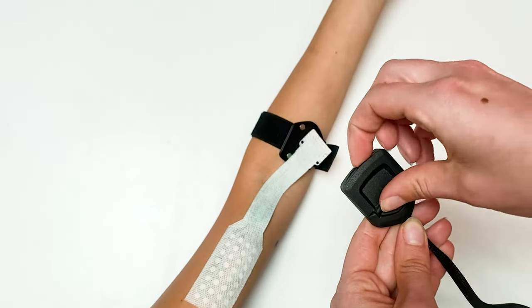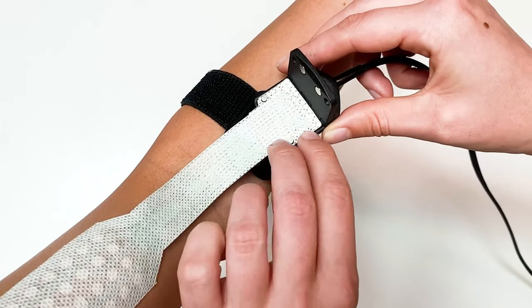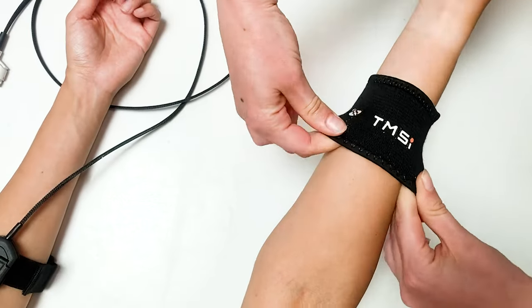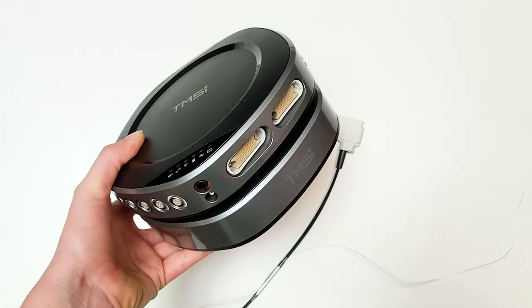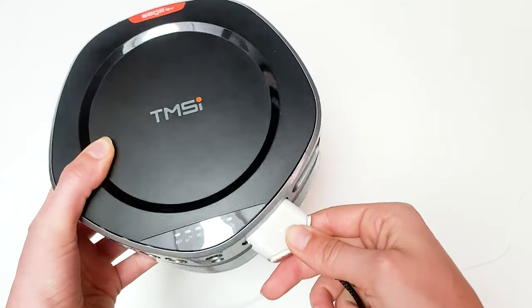Open the lid of the adapter cable and connect the grid by aligning the holes of the grid with the holes of the adapter cable, with the electrodes facing down. Put on and connect the patient ground electrode to the wristband. Attach the cable of the adapter cable to the SAGA by aligning the red line of the connector to the red marking on the SAGA.